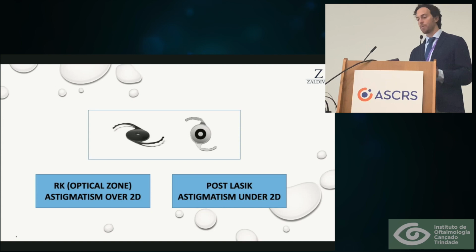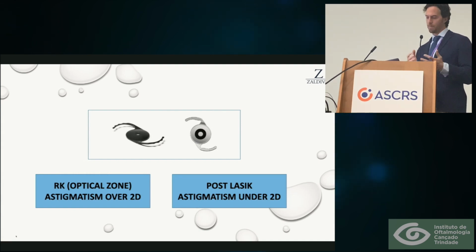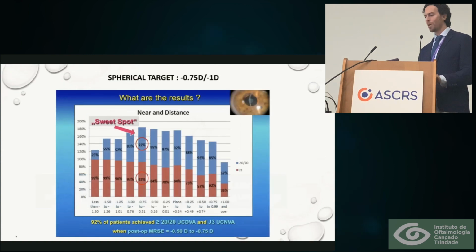Both of them are not treating astigmatism. They are compensating astigmatism by decreasing the aperture. What do I do when we have high astigmatism that we see has some sort of regularity that will improve with a toric IOL? We put a toric IOL in the bag and the Xtra focus over it. The IC8 doesn't have toricity, so that's one of the things that we decide on. So that is something I would like to talk about, and perhaps we can exchange some thoughts.